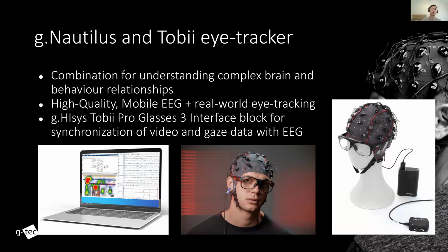They look at different products, and the eye tracker can pinpoint where the gazing of the subject is. If you see where my mouse cursor is pointing, this is how it looks when we are tracking the eyes. The red dot means the subject is focusing on that particular area. Imagine if we are placing, say, 10 products in front of the subject, you can already know what type of product is more attractive to the subject.